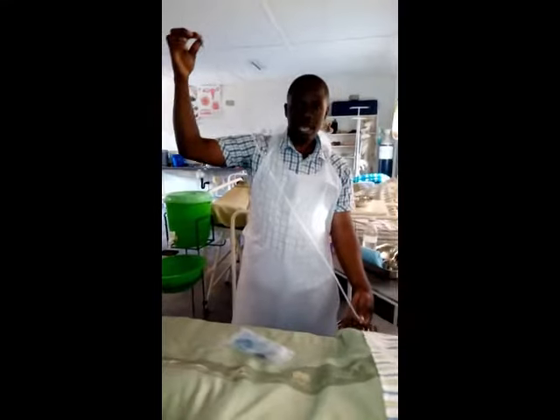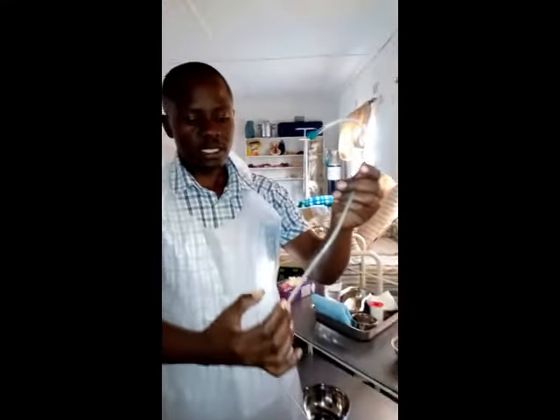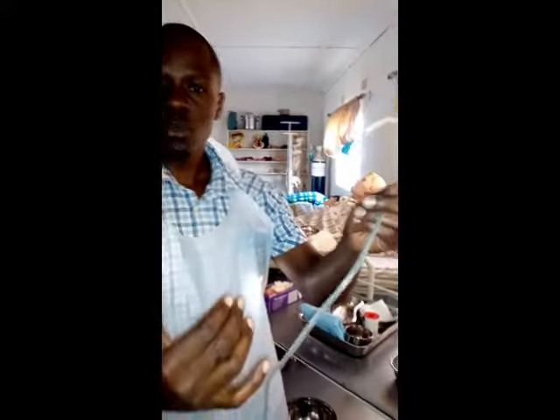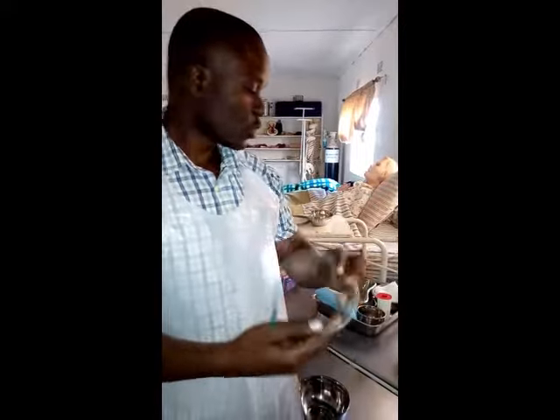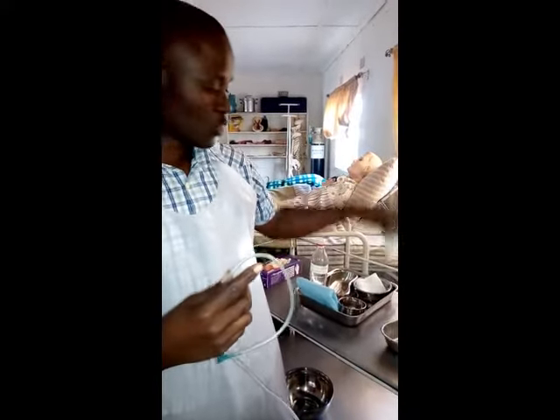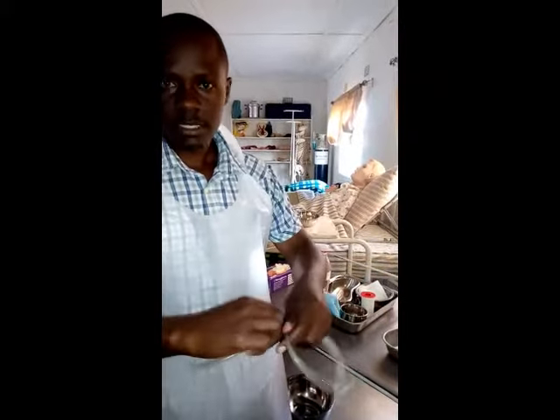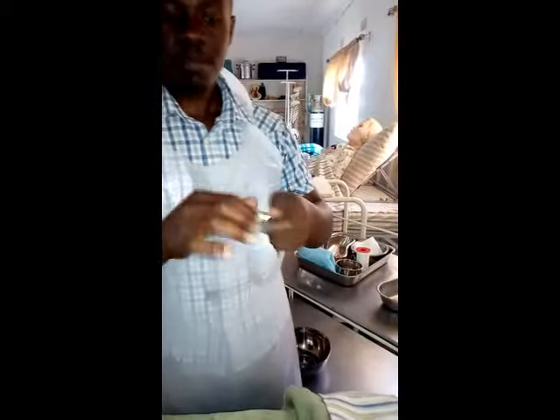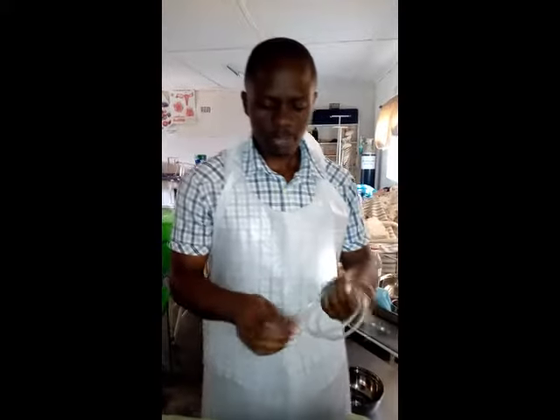This tube has got markings. Sometimes we don't depend on the markings, so we need to follow the procedure of using a tape. We're going to use strapping, which is here, so that we mark the length which will be inserted. So this is an adult tube, but we've got sizes. They range in sizes.